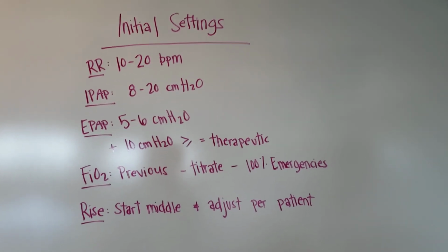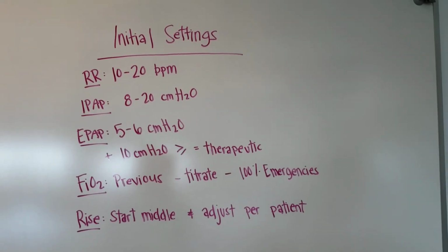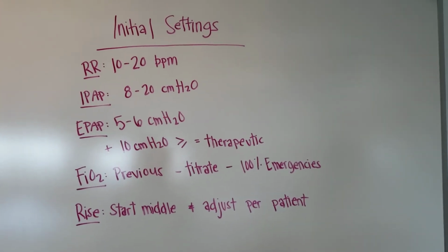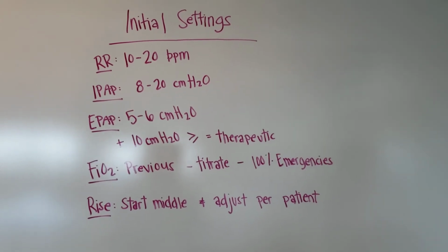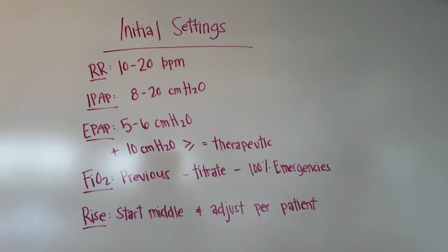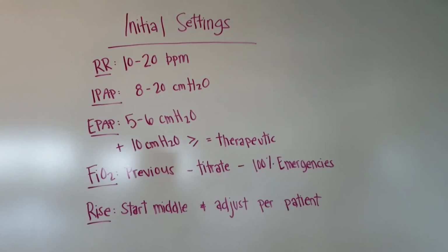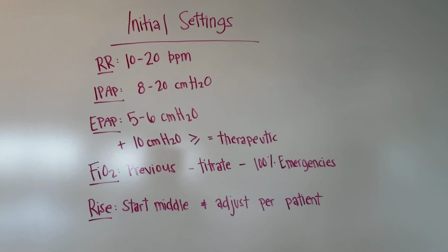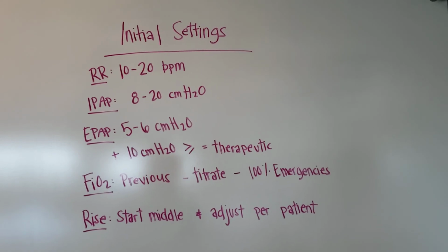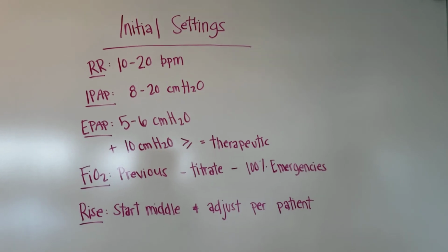I like to think of BiPAP as the Band-Aid of respiratory therapy. We are trying to cover up the gaping wound that is respiratory failure and trying to get them to a point where they are stable using non-invasive methods. So I am a huge advocate for BiPAP. It can be well tolerated. A lot of patients will find the mask a problem. Some patients have claustrophobia issues. So that is something to keep in mind, is claustrophobia. But BiPAP does a lot of good work. It helps a lot of patients, and I am a huge advocate for it.